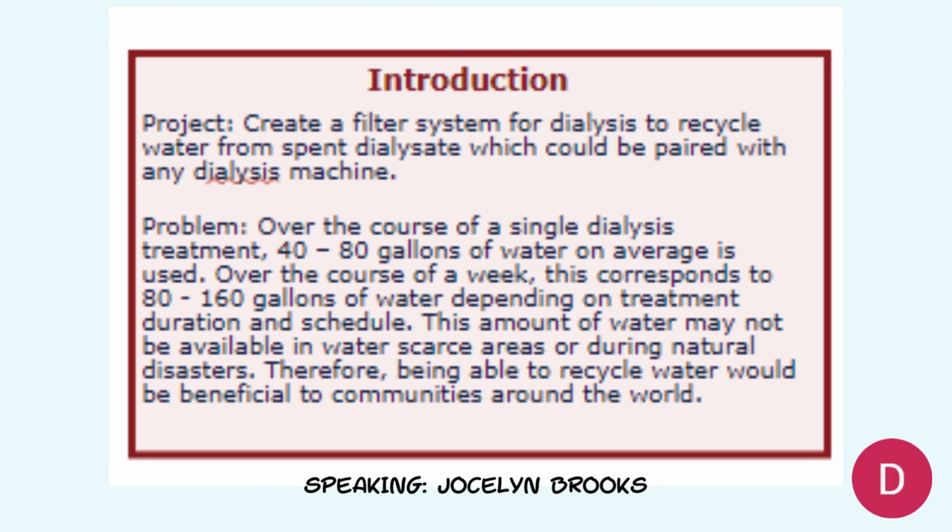This water may not be available everywhere. For example, in water-scarce areas, this amount of water may be hard to come by or be really expensive. And it is important during dialysis to have a clean source of water during natural disasters. Our project is aimed at being able to recycle water initially used in dialysis during these times.